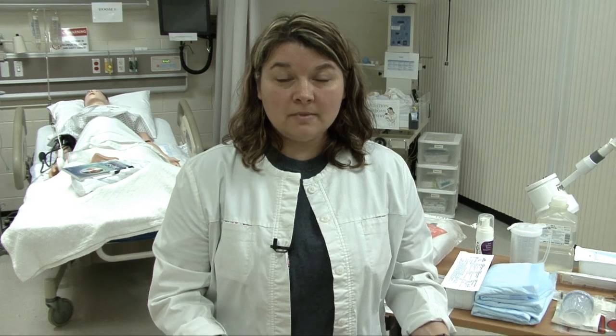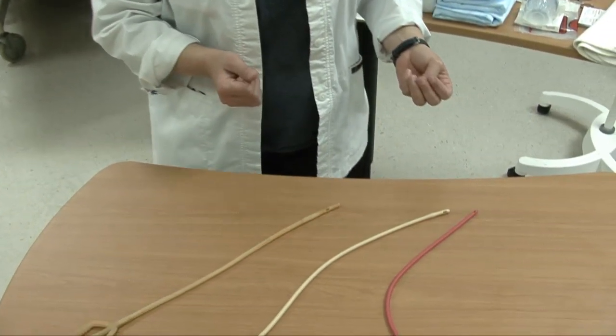Good morning, my name is Heather Cox and today we're going to talk about catheterization. I'm going to show you some equipment before we start and then we'll move to the bedside and talk about some other things that you need to do before you perform the catheterization. If you'll look down at the table, I'm going to show you some actual catheters and talk to you about them.